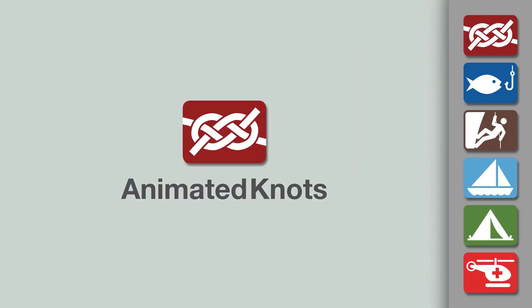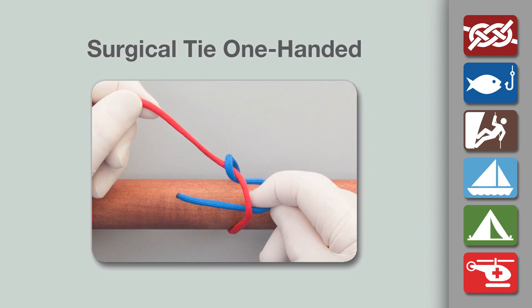Welcome to another knot tying demonstration from AnimatedKnots.com. This video teaches you a surgical tie using the one-handed technique.